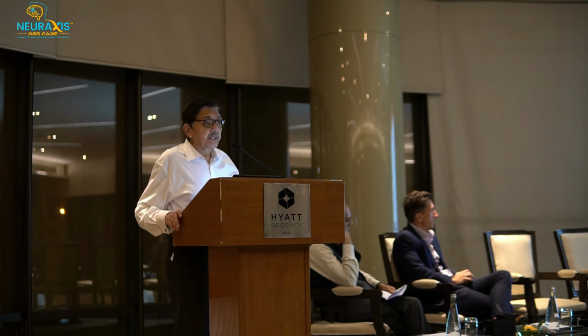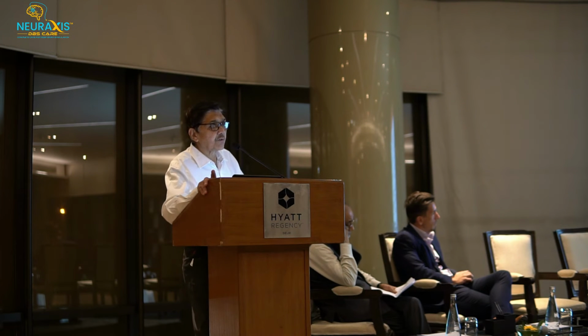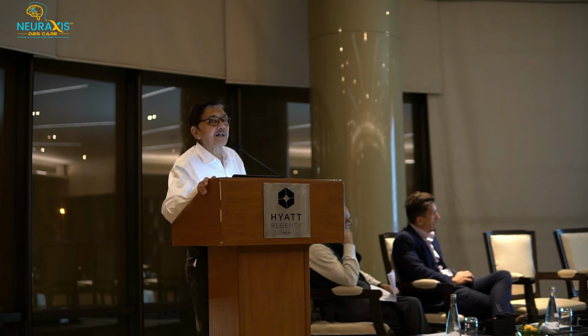Yes, it is very important that the patient and the family should know what are the risks of the DBS. They should not think that we are doing some magic. We are not doing any magic. This is a surgery which involves risks, complications and sequelae. About 3% of the patients, according to the world literature, have brain hemorrhage, so they can develop hemiparesis. 5% is the rate of infection, because we are implanting an external thing in the body, and therefore the chances of infection are a little high as compared to other surgeries, and therefore we cover them adequately with antibiotics.